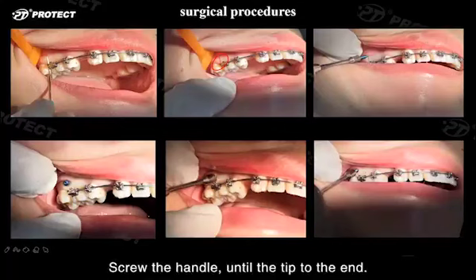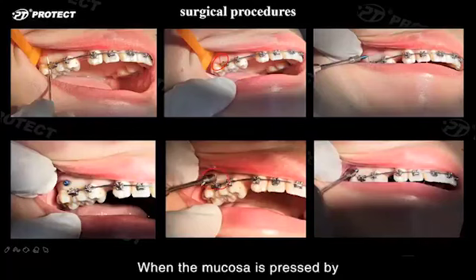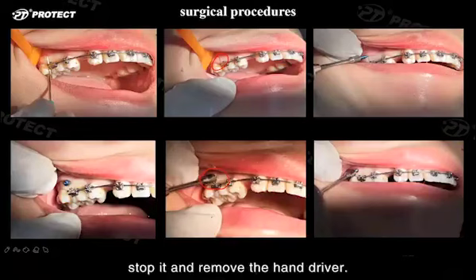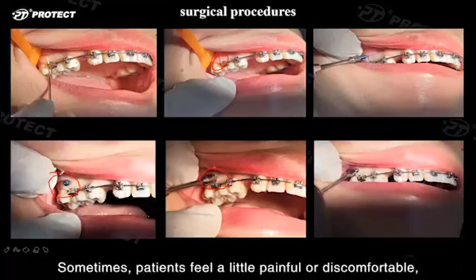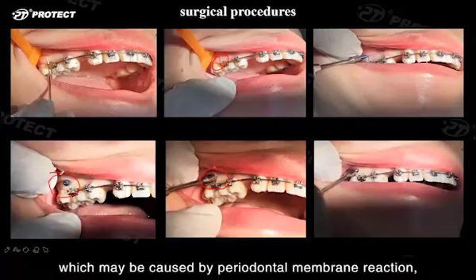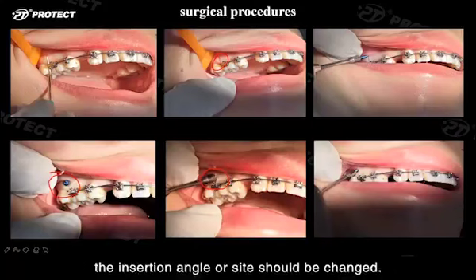Screw the handle until the tip reaches the end. When the mucosa is pressed by the tip and begins to whiten, stop and remove the hand driver. It's finished. Check it with a probe. Sometimes patients feel a little pain or discomfort, which may be caused by a periodontal membrane reaction, when the micro-implant clings to it. In this condition, the insertion angle or site should be changed.